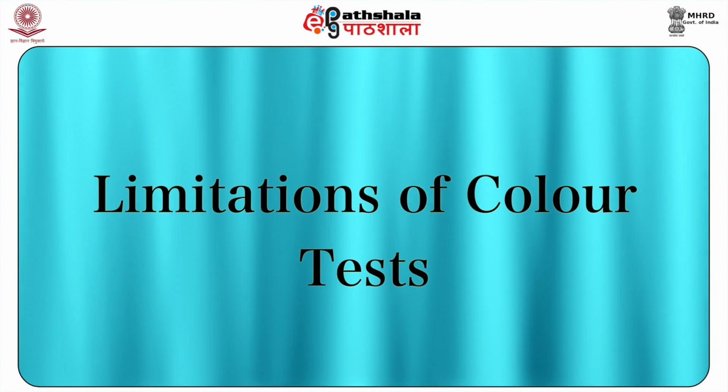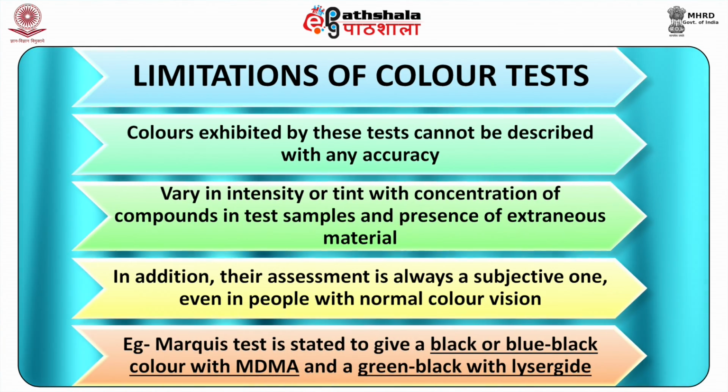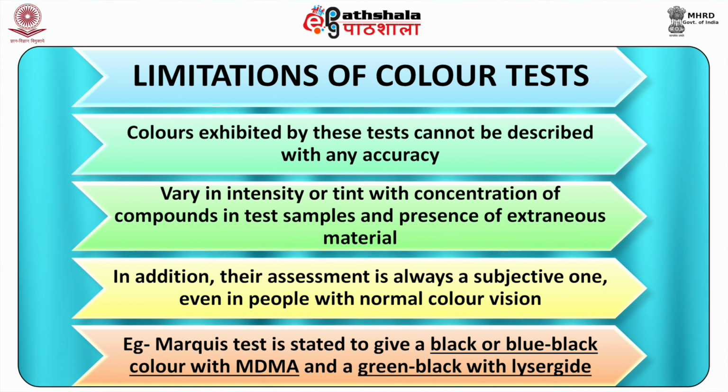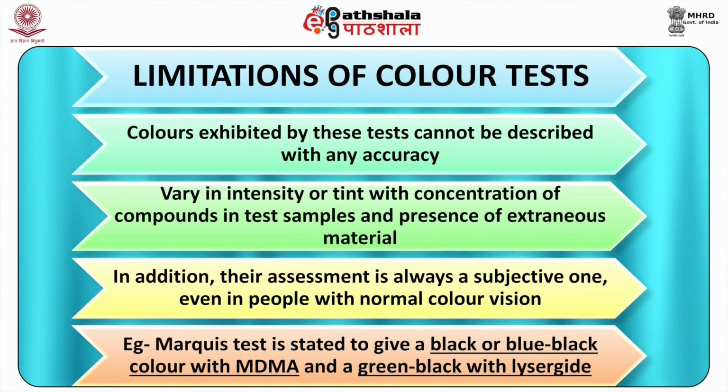Now we will study the limitations of color tests. Colors exhibited by these tests cannot be described with any accuracy. They may vary in intensity or tint with the concentration of compounds in the test samples and the presence of extraneous material.